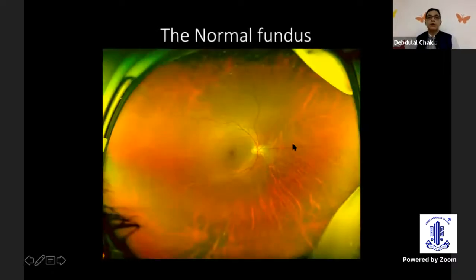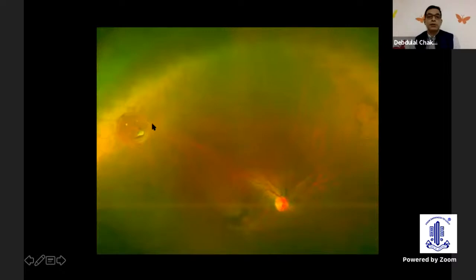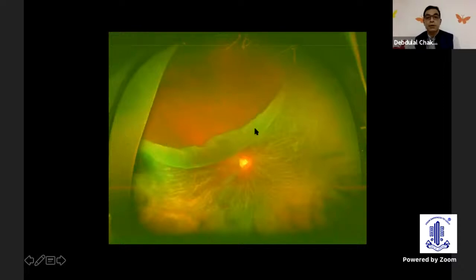So you can capture a fundus like this, a basic normal color fundus, so to say, in a normal person who's just coming for a screening. Or it could be something a little more serious with this lattice. It's an early lattice that is seen in the supratemporal periphery here. And of course, it could be something a little more concerning, a break here in the supratemporal quadrant, something a little more ominous, a large break with a total retinal detachment, which needs immediate attention.